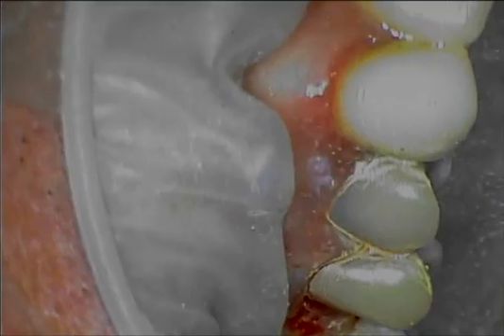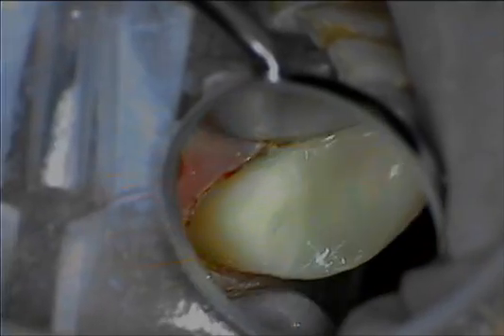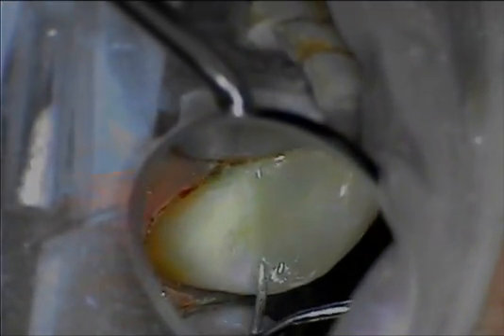It's a very light touch necessary to remove that Resoment. Then we'll rinse and polish with some fine diamond paste. Here you can see how nicely the margins just disappear into the enamel — it's very hard to detect a cement junction. Once that palatal cusp rehydrates, that will look very nice. That restoration adjacent was cemented approximately two years ago with Resoment.